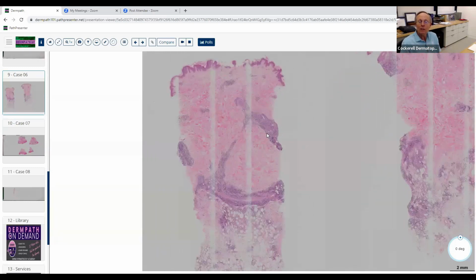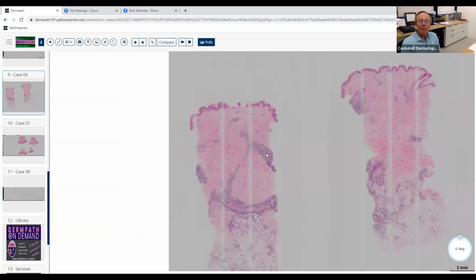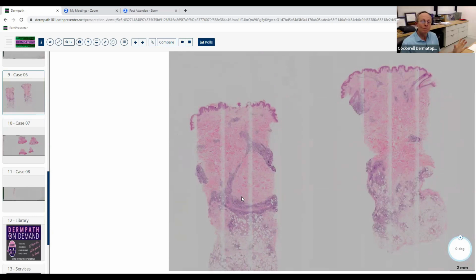So yes, we're going to say this is probably mostly lymphocytic, and we know that how many diseases give you a lymphocytic infiltrate mostly around blood vessels at low magnification? There's not 100. There's only about 7 or 8. And we have a mnemonic device for those 7 or 8, right? What do we talk about when we see lymphocytic infiltrate at low magnification, superficial and deep?